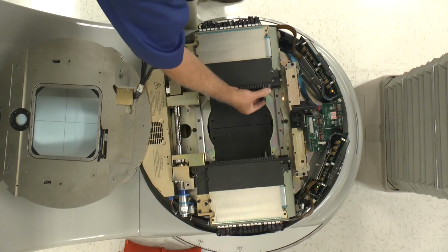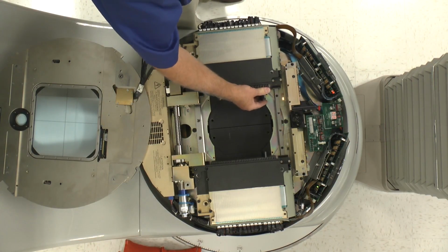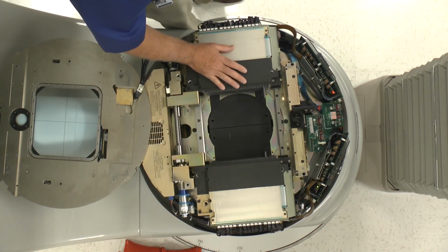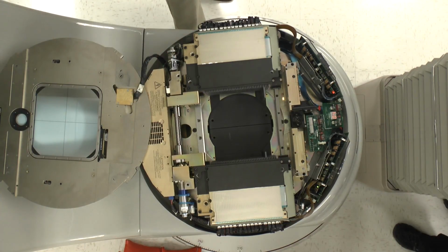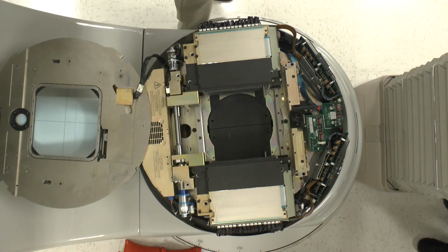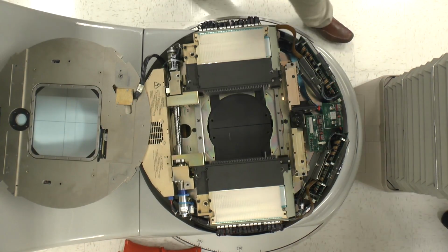So you can grab a leaf. They're mounted in fairly stiff with the leaf screw. At this point, if you turn the power off, you'll have to reinitialize. But since we're going to play with disconnecting things, we'll shut the power off. We can turn it on, we don't have to initialize, and we can use the service panel to move any leaves.